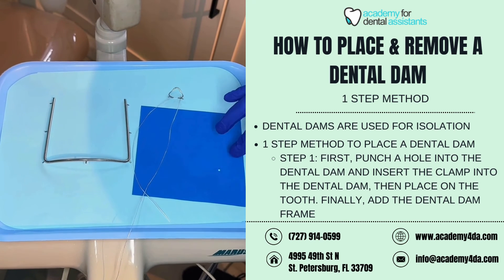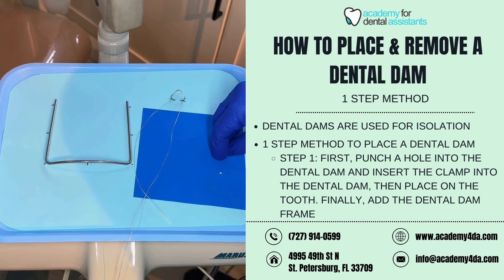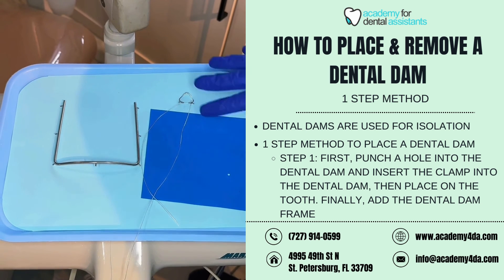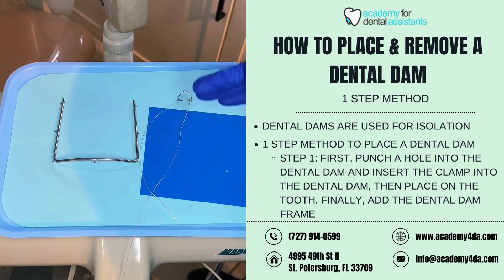Once you have removed the clamp from the patient's mouth, it's important to check that your dental dam is still fully intact. If you notice any voids, extra holes, or rips that weren't there before, you'll want to use an additional piece of floss to floss the mesial and distal contacts to make sure the tooth is cleaned out and that dental dam material is not stuck between the teeth.